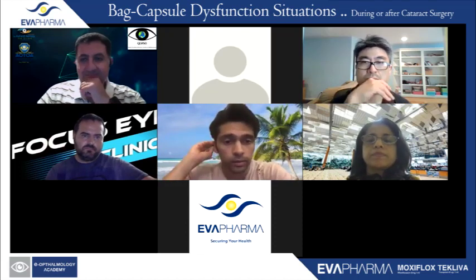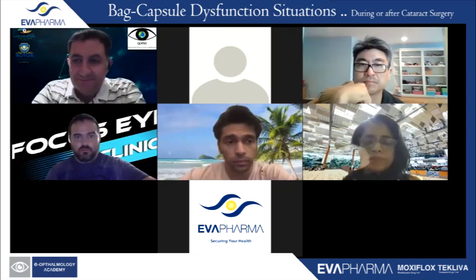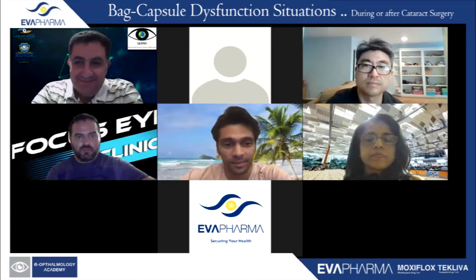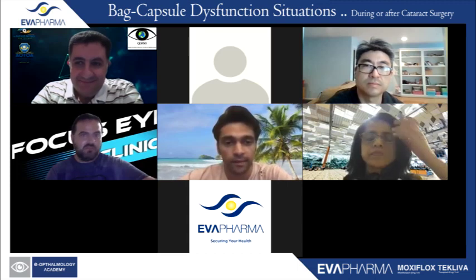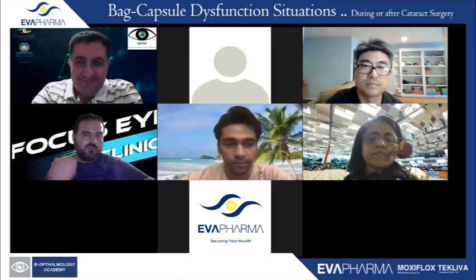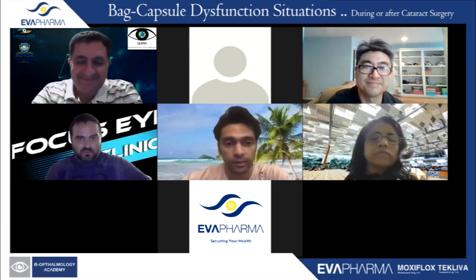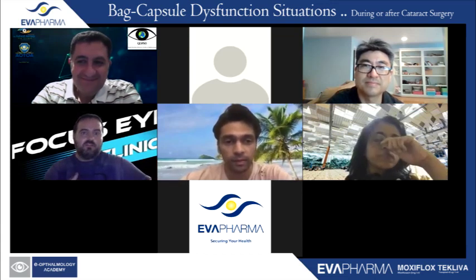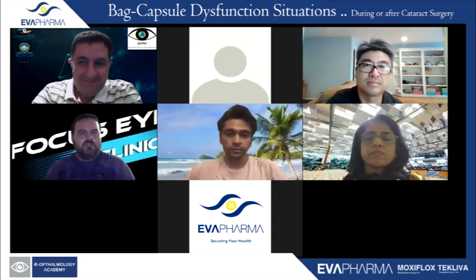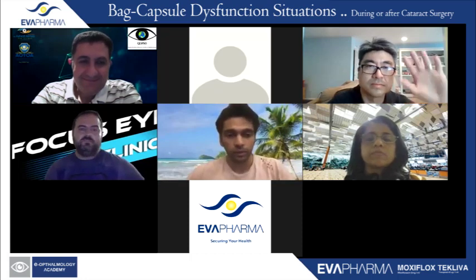Yeah, go ahead, Lukan. First of all, I want to congratulate you about your marker. I bought one from Epsilon and I'm using it for Carlevale lens fixation, and it's remarkable. The second thing that I really liked is how you meticulously cleaned the Soemmering remnants. I've heard of surgeons that don't do that, and this is a source of CME, secondary glaucoma, and everything that could go wrong. So perfect job. Congratulations. Thank you, Lukan.